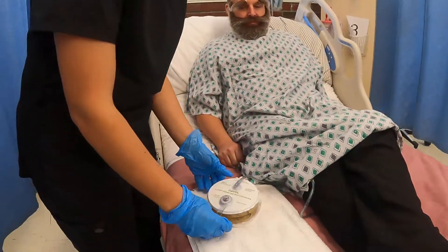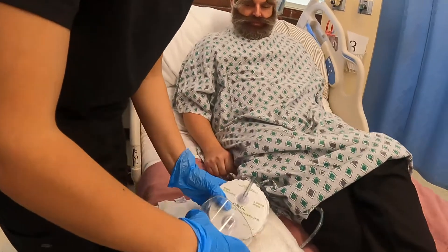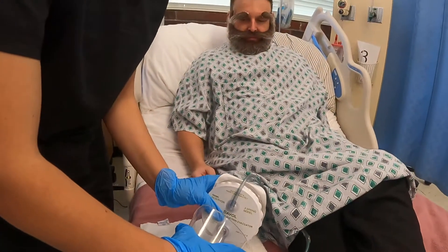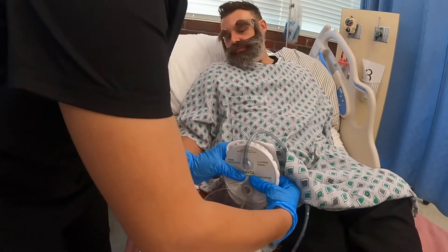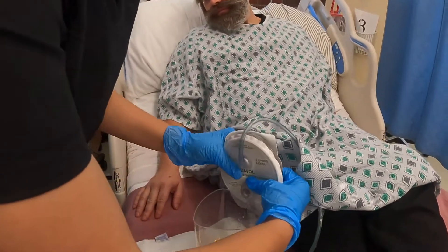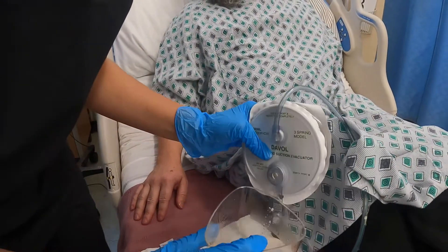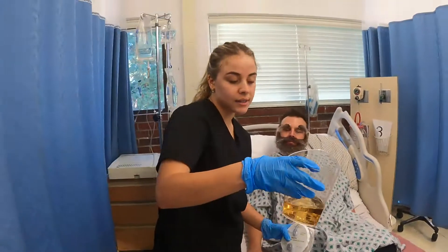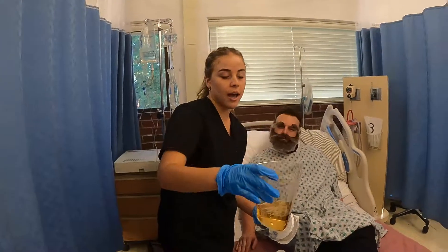What I want to do is simply open this up away from you, get my cup ready, squeeze all the fluid out, and then assess the color and how much Hector is draining.